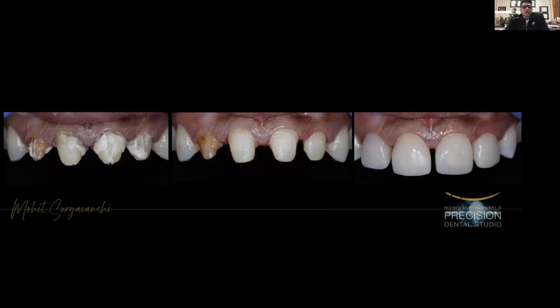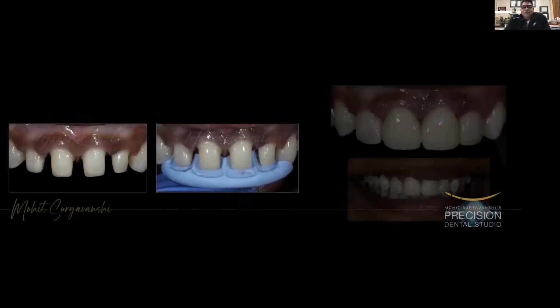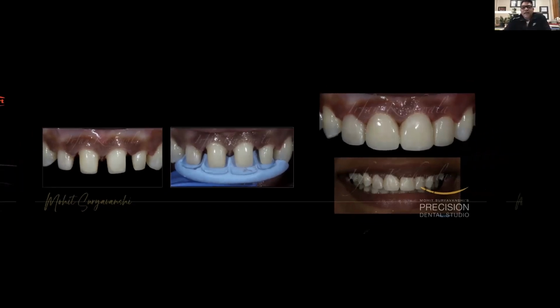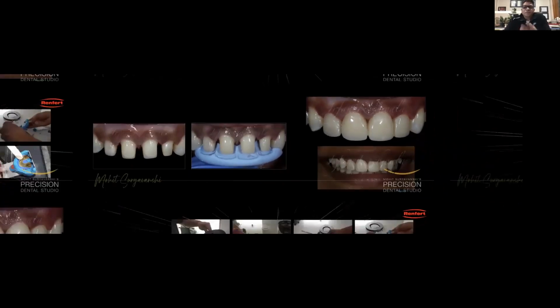This was the earlier preparation. The case was treated by a dentist friend of mine, and the earlier restorations were removed. On the extreme left, you can see that after the immediate removal of the restorations, a proper treatment and proper contouring of the preps was done. Then we had a wax-up done, on the basis of which you can see there is a silicon matrix. We sought the patient's approval of the dimensions and the overall aesthetic, how it looks pleasing to her. Once she was happy, we started with the processing.